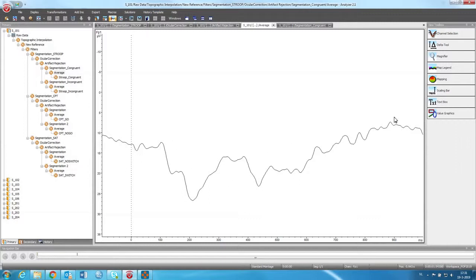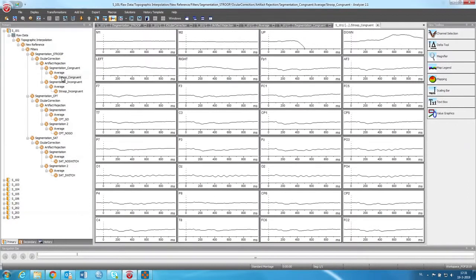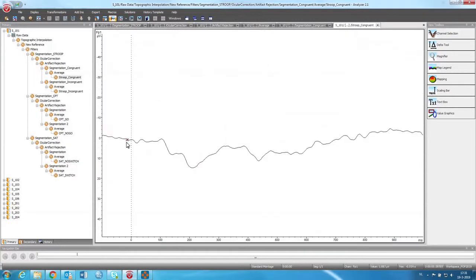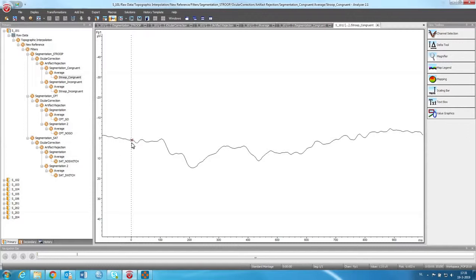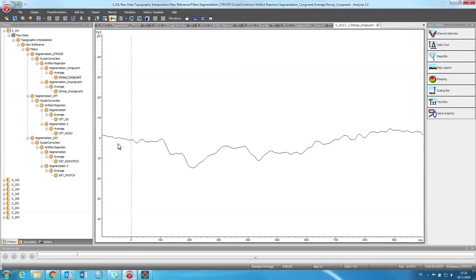Then the final step is to baseline correct it. If we click on there, you can see that now it's nicely baselined around zero. And it uses this part before the event starts. The event starts at one over here. And it's nicely baseline corrected. So the ERP is nicely on the baseline. And that's the final step.